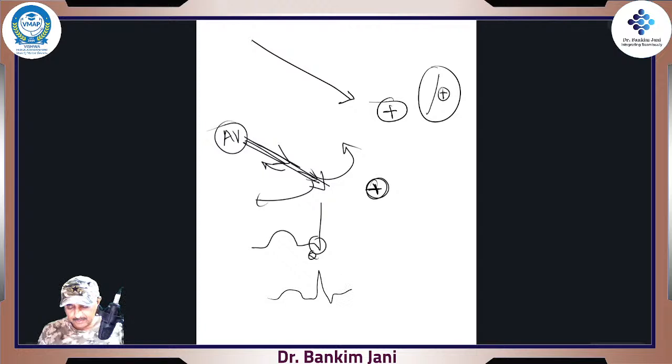Because current is coming, so this is a baseline, when nothing has happened. And the moment this AV node fires, it will come towards the electrode, so it should go up. It is not like the current takes a slightly reverse turn and then goes towards it. No, this never occurs. For this, there is really one very, very interesting fundamental thing.